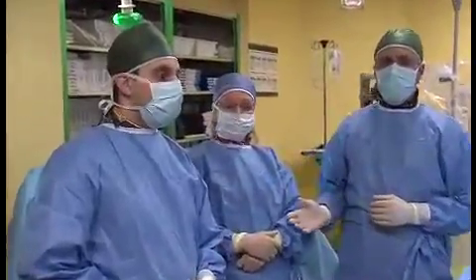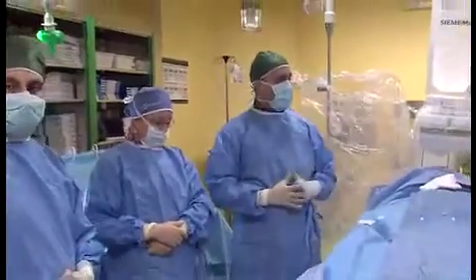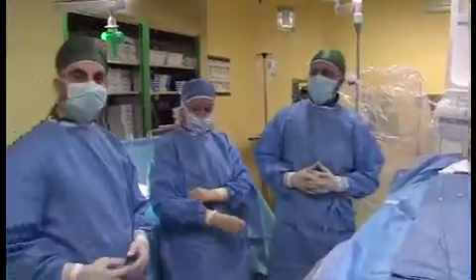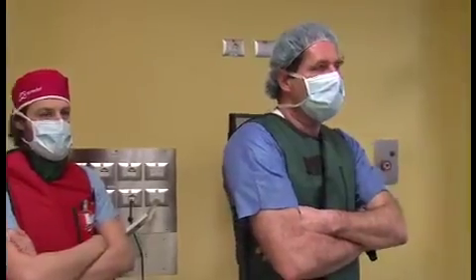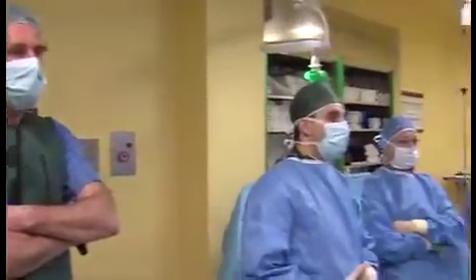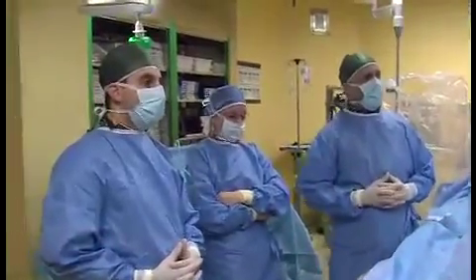I would like to introduce our co-workers here: Dr. Luca Giugno, Dottoressa Piazza, Miriam, radiologist, and Lina, Federica and Tommaso as anesthesiologists, and Gregor, who is helping us with the 3D rotational angiography. Luca will introduce the case, please.